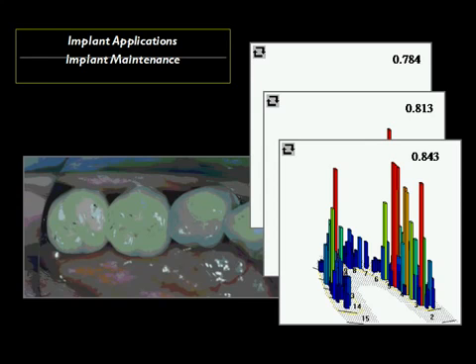Took another recording. And now we're seeing this scheme. If I play the movies, once again, we're seeing contact on the anterior implant abutment. There is light contact on the posterior implant abutment, but as I play it forward again, look at the significant contact on these two implants without primary contact on the natural teeth. And that is after I've adjusted the implants.